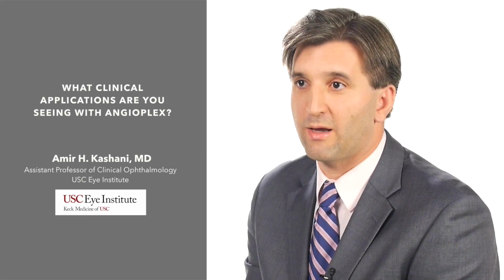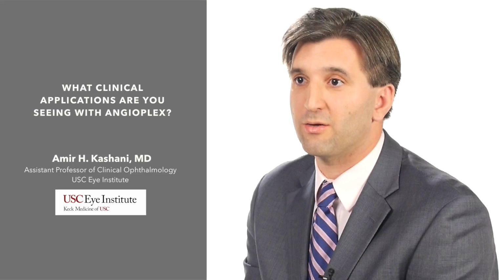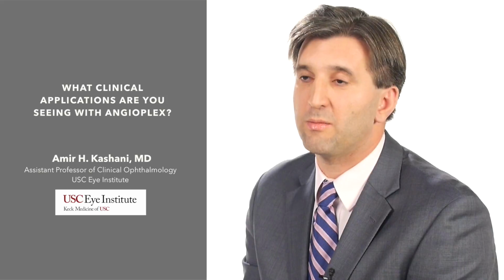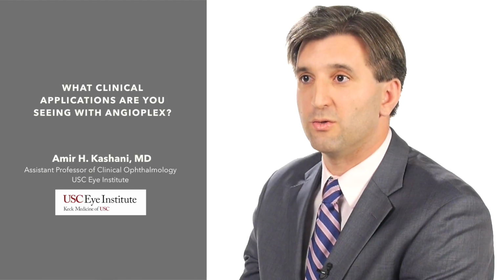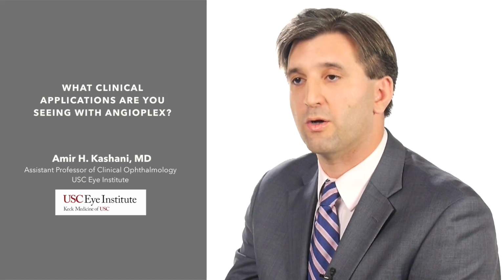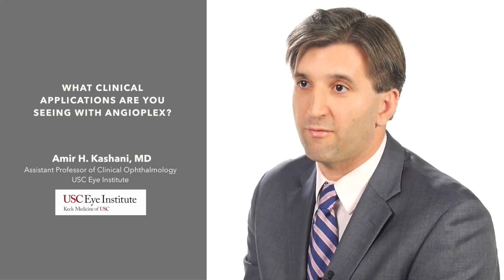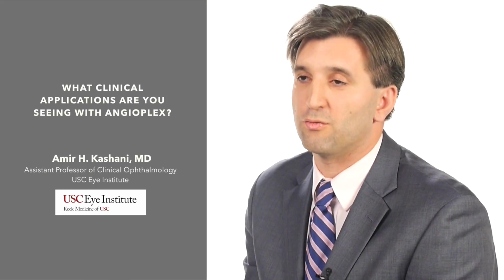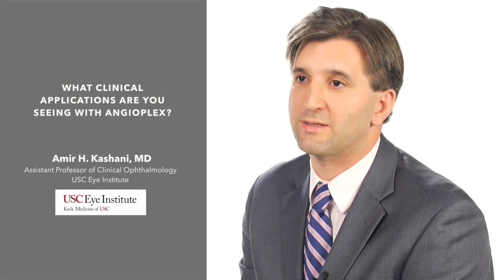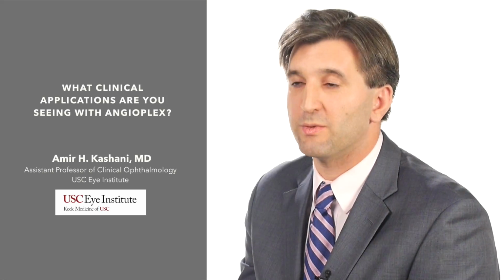Well, now when we have OCT angiography and the Angioplex, we can easily see the extent of the macular non-perfusion or the macular ischemia. And sometimes if we know that there's macular ischemia, it'll affect the way that we decide whether to do an injection, whether to follow a patient more closely, or whether to just tell them, look, we're going to try to do this treatment and it may not improve your vision as much because there's not enough blood flow there to support the visual function that we know you need. So there's a couple of different examples where people are using OCT angiography to change the management of their patients.